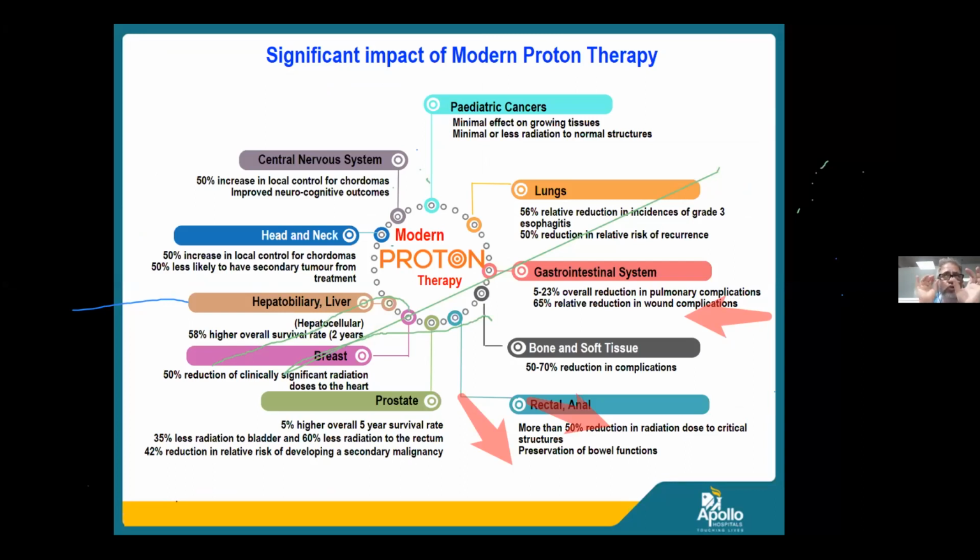You have to choose your patients carefully, as in any other cancer modality. You judiciously choose, and in many sites, as has been listed out in this slide, although the robust evidence is still in about 5 to 8 or 9% of the cancer cases, it is believed that in the next decade or so, the percentage of patients who will likely be eligible for proton, and as I mentioned, using the modern proton, could be even as high as 20 to 25%.